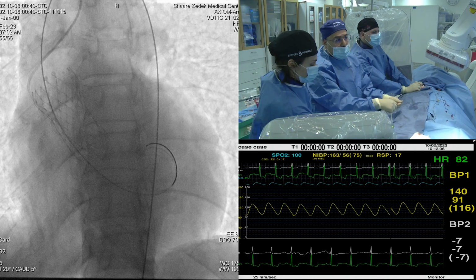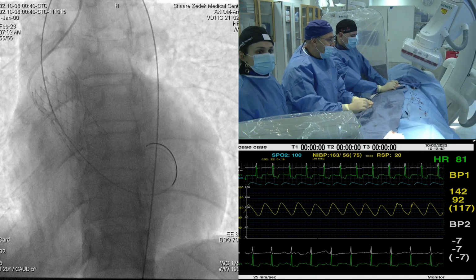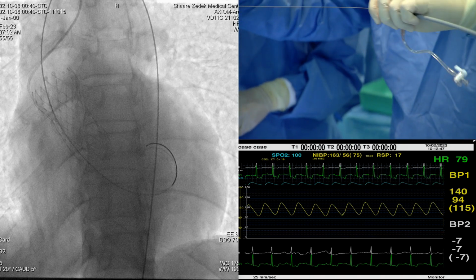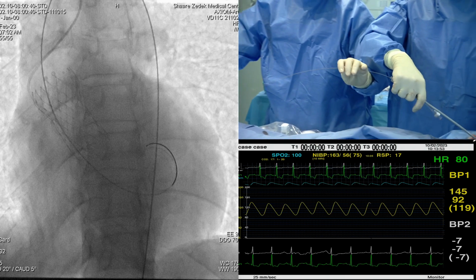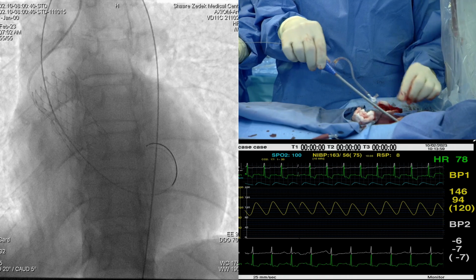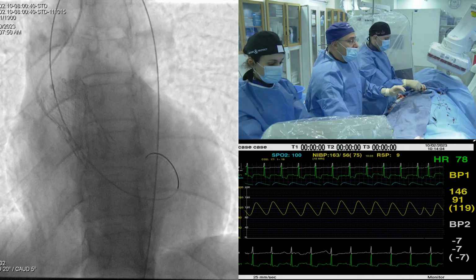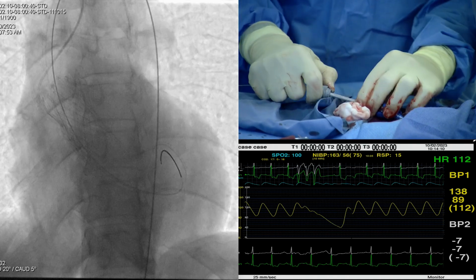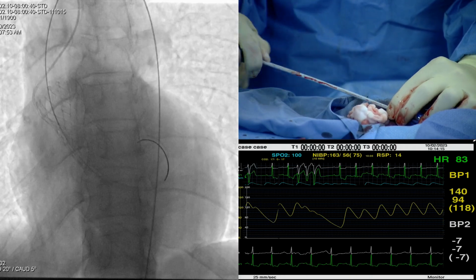Yeah. So the diastolic blood pressure is 90, which makes us all happy here. And we are bringing the sheath back. So Danny, just a comment here. Your patient is awake, I'm assuming, right? It's a minimalist TAVI. So how are you going to assess now? What's your next step? You're going to do transthoracic echo and hemodynamics to assess the results. Do you combine those results in terms of understanding whether or not there is PVL, if the LVEDP is stable or went high? What is your final assessment of the valve?